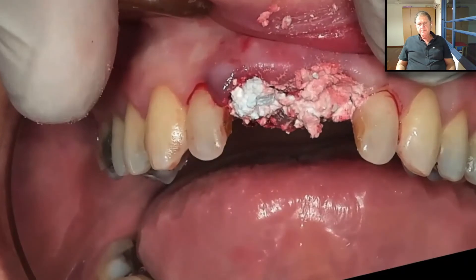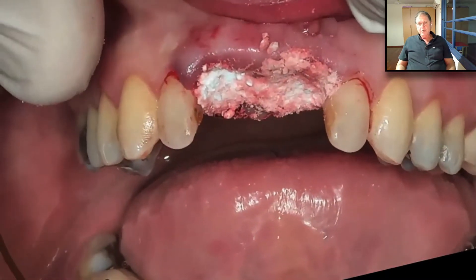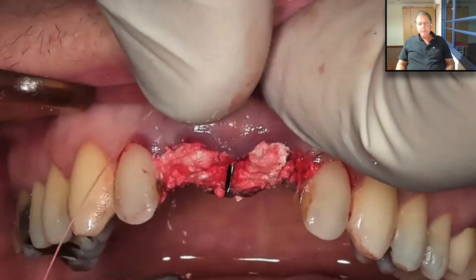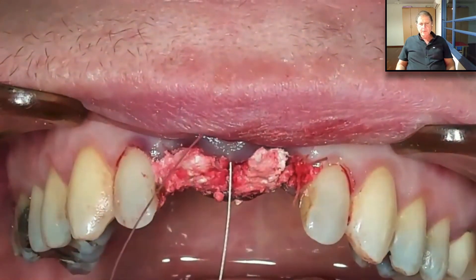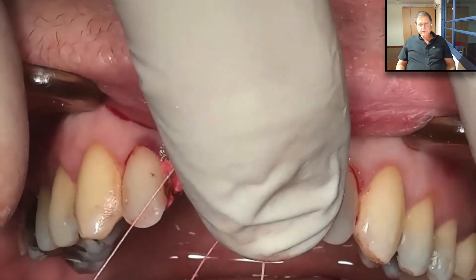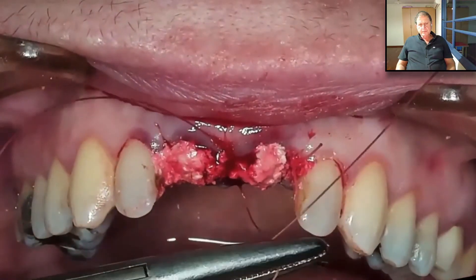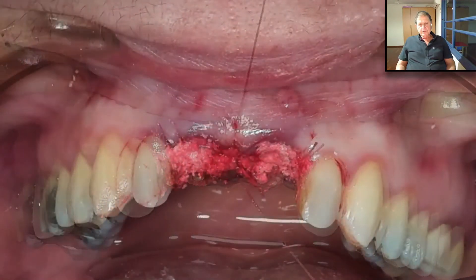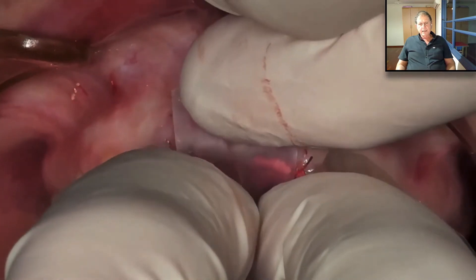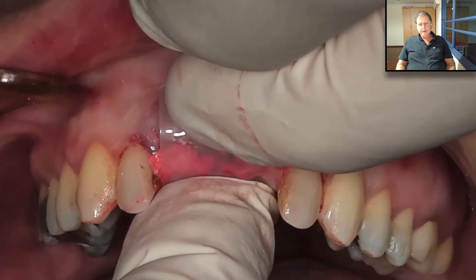We remove excess, press again. Before placing the Oraid, we need to clean the mucosa. Take a dry gauze and remove the excess cement from the side, then take a moistened gauze — not too wet — and go over the gingiva. That will give perfect adhesion. Now we suture the papilla in order to guide the tissue.